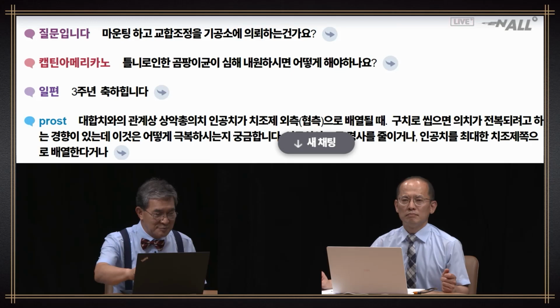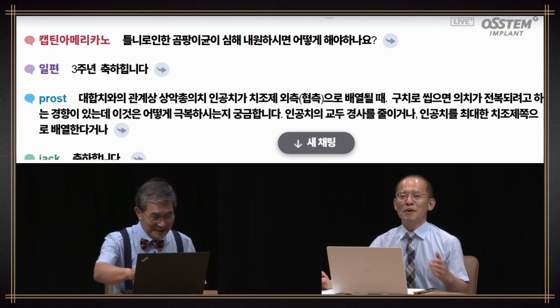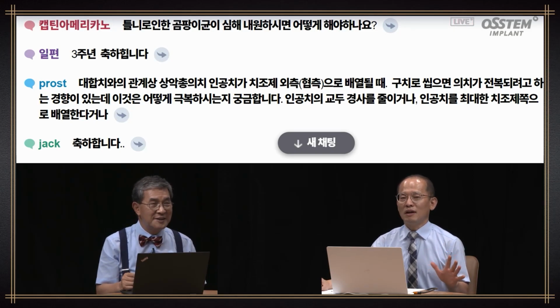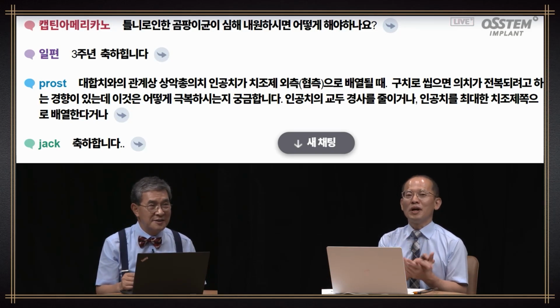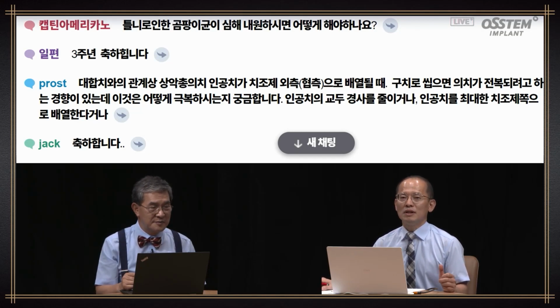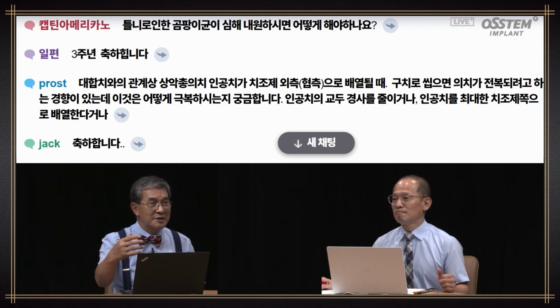Now another question from the person who asked before: do you ask a technician for the mounting? Well, I do it myself. From the beginning, I liked doing clinical remounting. So my target is always 20 minutes. So it takes a lot of time. In other words, you let the patient wait, or no, before the next appointment.